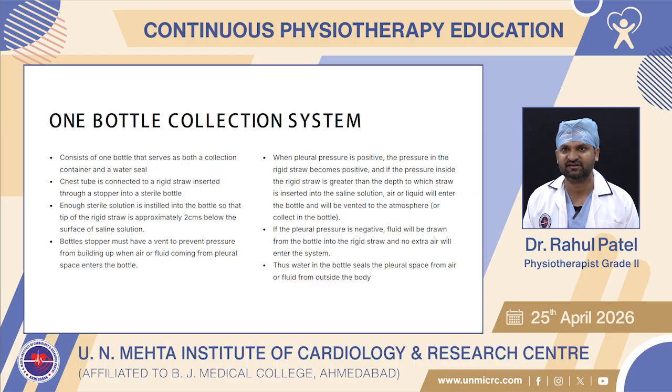If the pleural pressure is negative, fluid will be drawn from the bottle into the rigid straw and no extra air will enter the system. Thus, the water in the bottle seals the pleural space from air or fluid from outside.